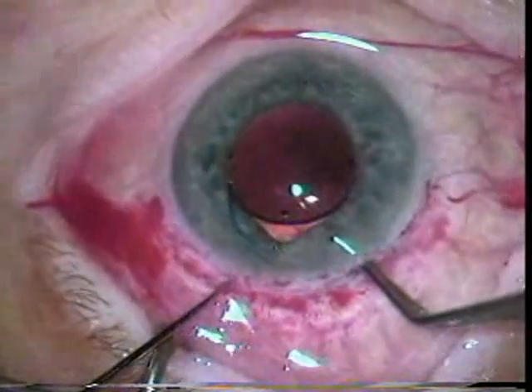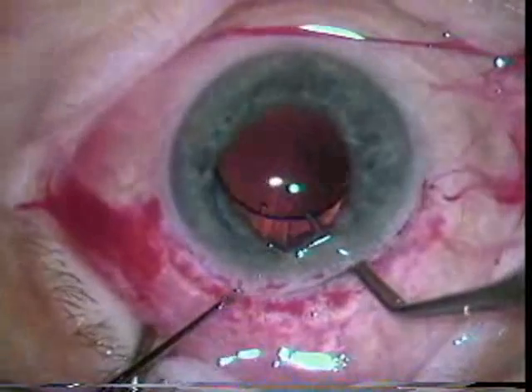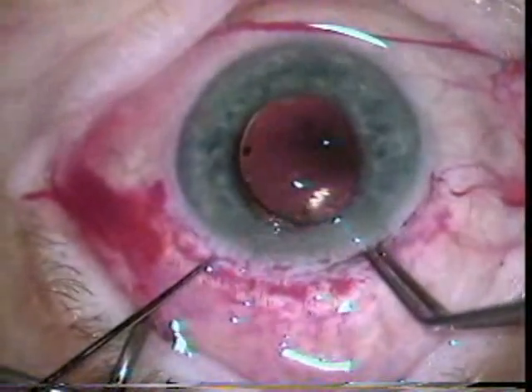Dr. Kolder is again using a two-handed technique to gently place this into the capsular bag.